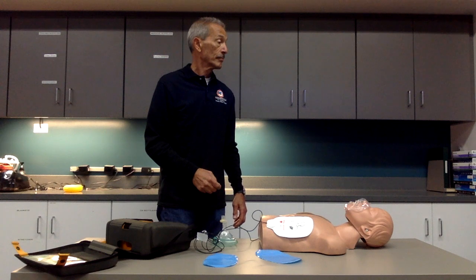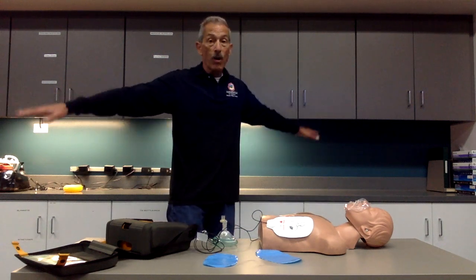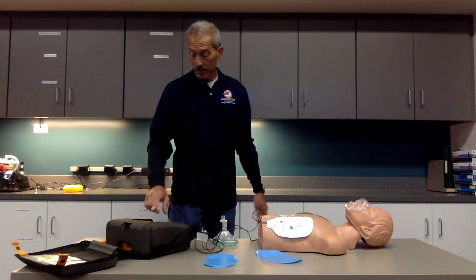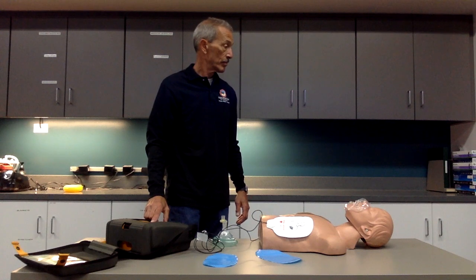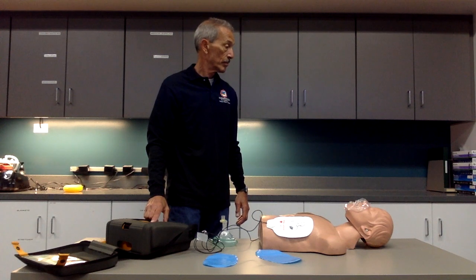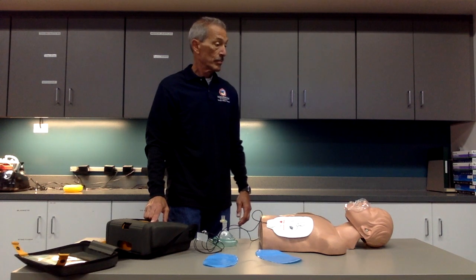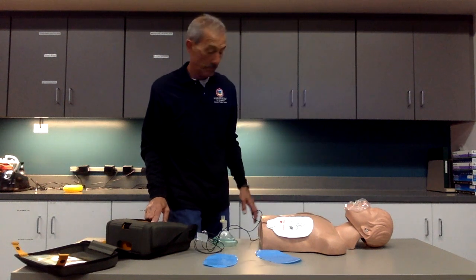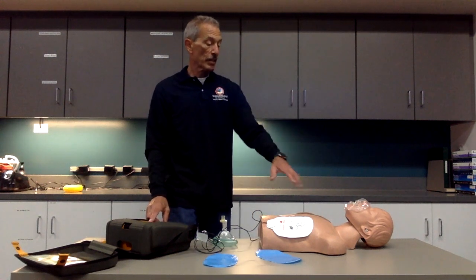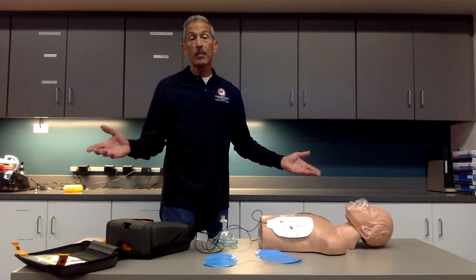Shock advised. Everyone clear — I'm clear. Shock delivered. Please get back on the chest and continue compressions. Start CPR. You're done with the skill.